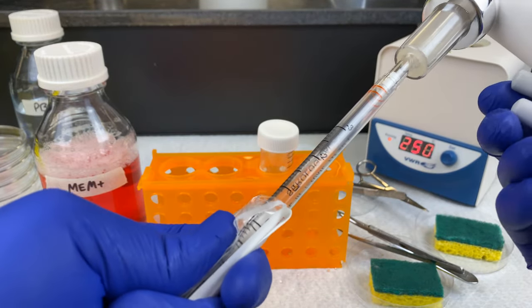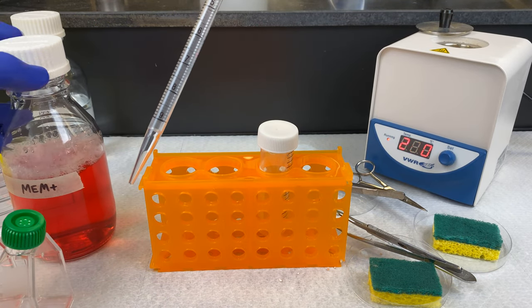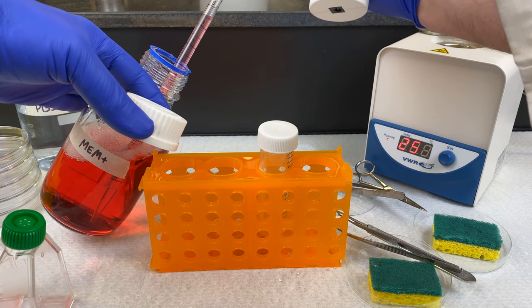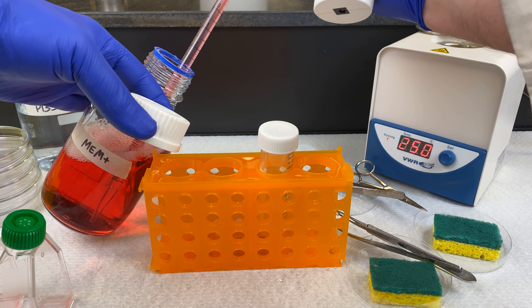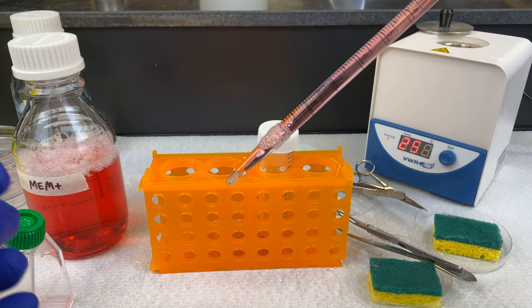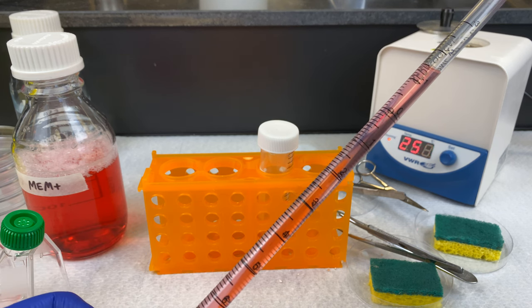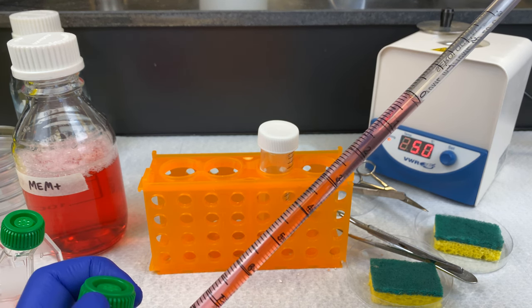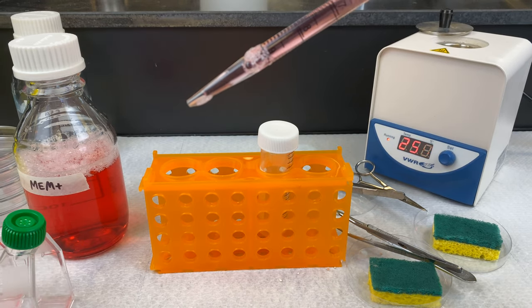I'm looking for the ideal concentration — the Goldilocks flask. If it's too high, I can use the low-concentration one. If my concentration was too low, I can use the high-concentration one. Liver cells often look different from what you may be used to — they often grow as more rounded cells and do not elongate as much as other cells you've probably worked with in tissue culture.